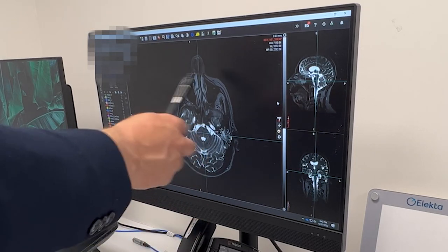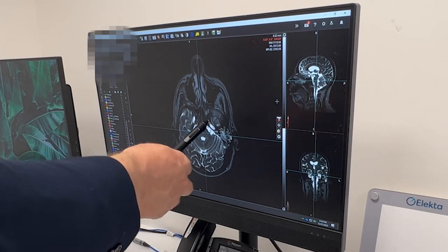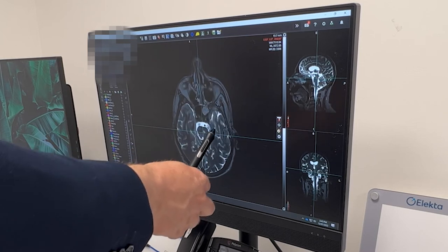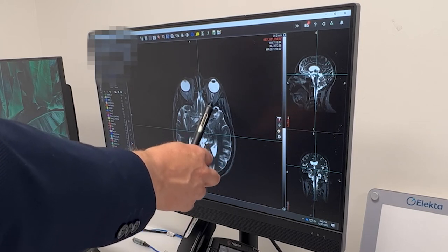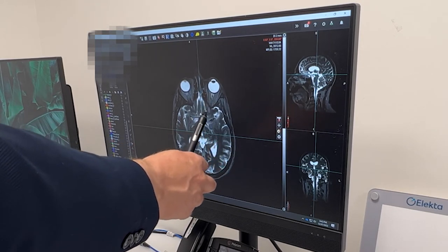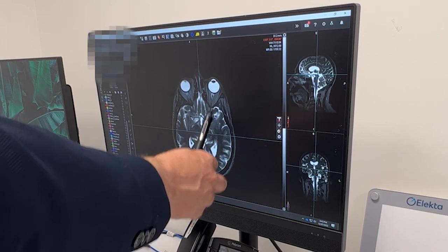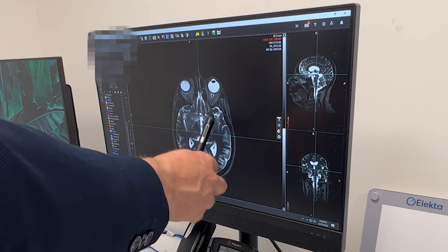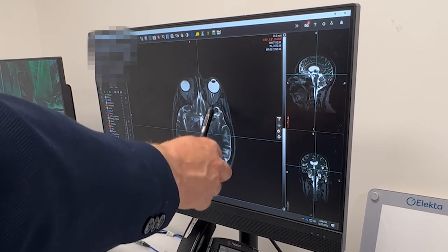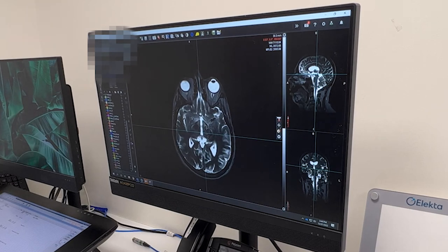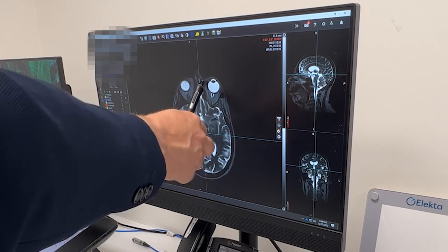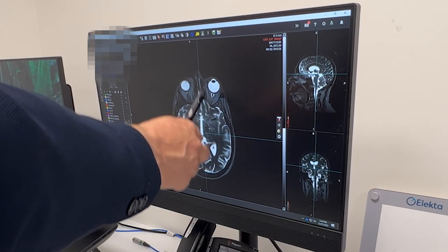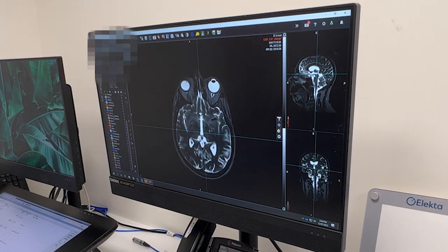The other thing this MRI — the MRI scan we got on the scanner — shows us, if we go further up, is more of the brain and here are the eyes. We can see the optic nerve, which is the nerve that leads from the back of the eye and is obviously very important for sight. We can see the location of that in relation to where the tumor is and where we're wanting to give the high dose. It's very hard to see that nerve on a standard linear accelerator, where we just have degrees of gray rather than seeing all the soft tissues clearly — like the ocular and eye muscles — and various parts of the brain with much more detail.